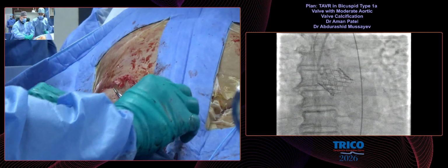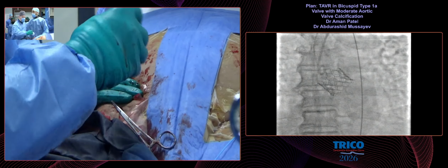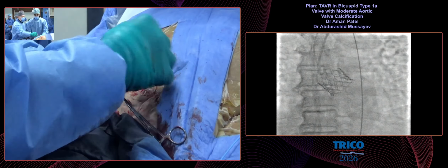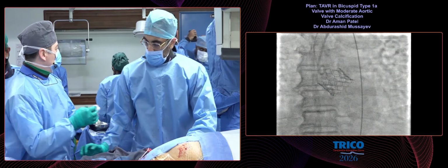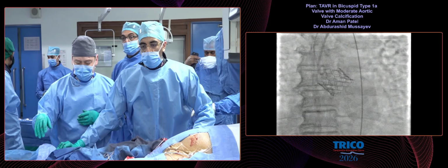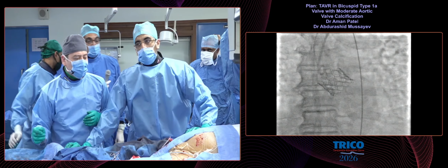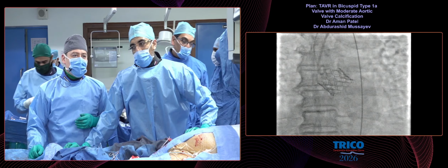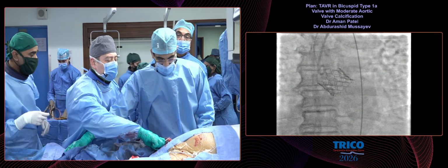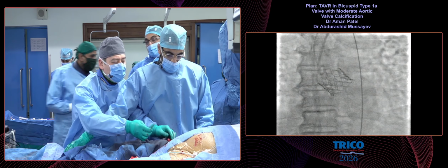Was protamine done? Half of the heparin has been reversed. Now we'll compress for 3-4 minutes here. There is no bleeding, and I think it's good. I like to palpate the peripheral pulses after achieving hemostasis, just to make sure that we have not occluded the artery.